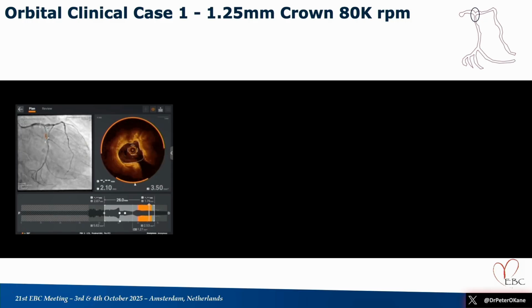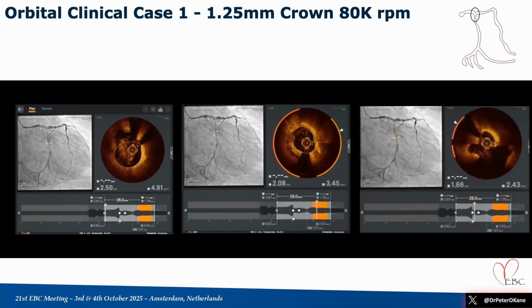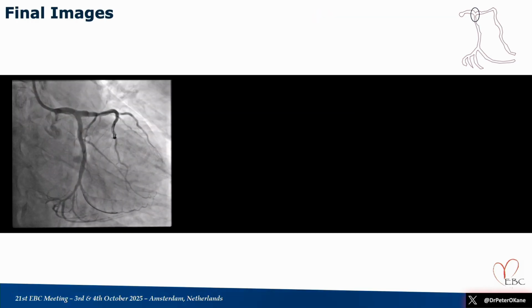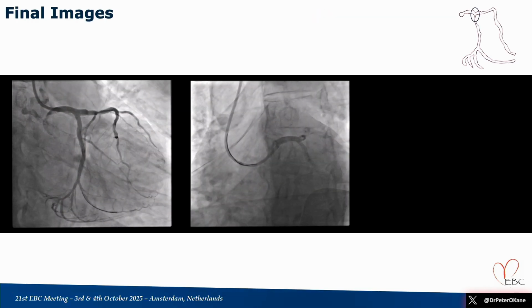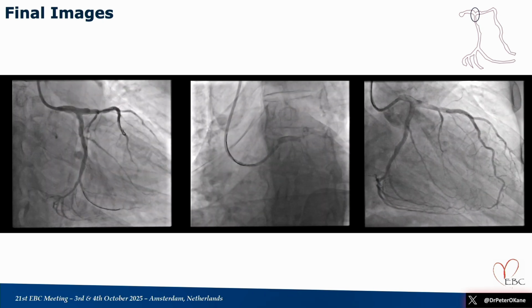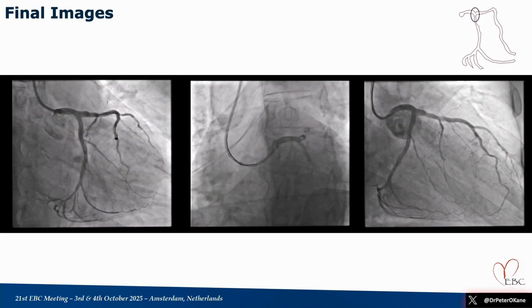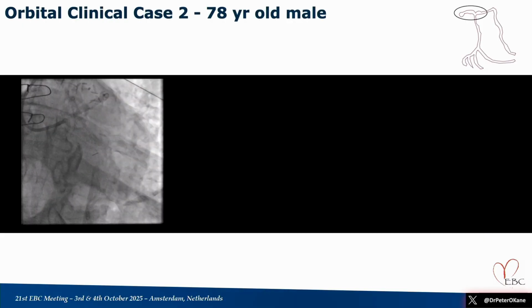That's the OCT. It's not the best run. You see there's a bit of swirl. And there are some fractures there, and we see a little bit of the concave effect, but it's certainly very disrupted. And actually, patients tolerate these very well, I find, and it's very effective here. We finish with a stent in the circumflex, and then we DCB the LAD, as we've heard, the hybrid approach. I think that's the best for this type of scenario. You don't want to put two stents in with that burden of calcium.